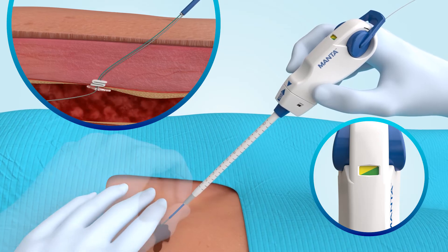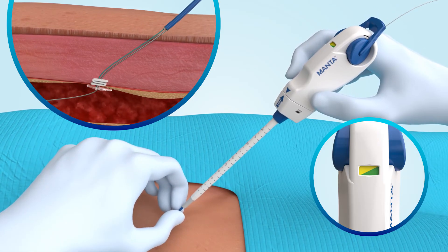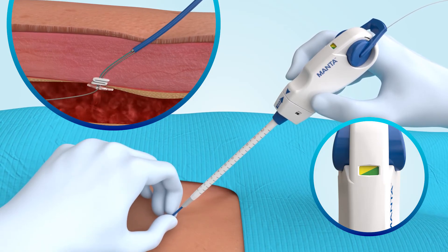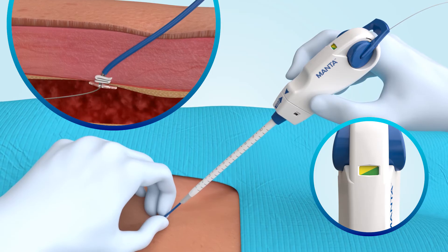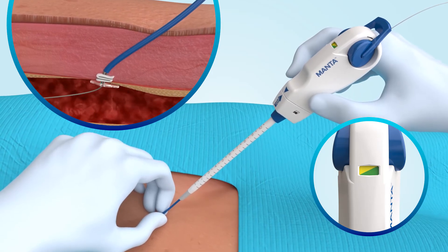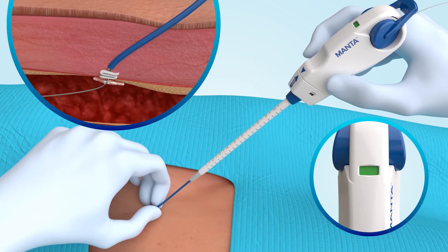Maintaining this yellow-green tension, gently advance the lock advancement tube to position the radio-opaque lock. While stabilizing the vessel with the lock advancement tube, retract the device slightly until a click is heard. The access site is now sealed.